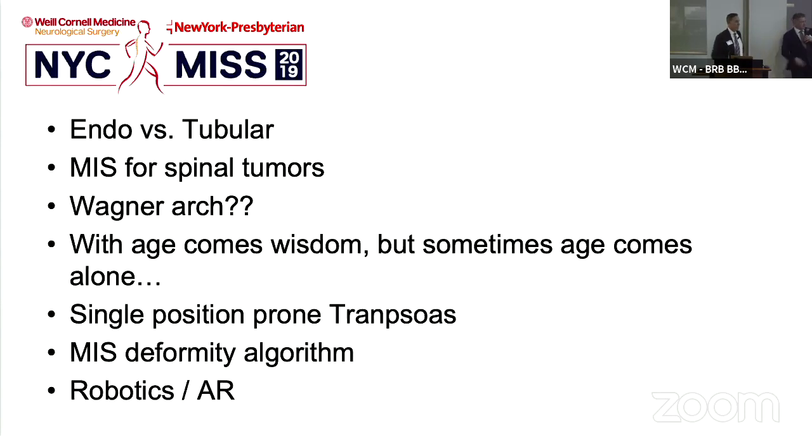Yeah. But let me ask you that question now. When navigation was introduced, the data show that there's a real reason why navigation is helpful, because it improves accuracy, right? What's really the advantage of augmented reality for pedicle screws? Is there anything other than, is it like endoscopy versus tubular? Is this another way of doing a microdiscectomy? Another inflammatory comment, or is there a real advantage? Or is the advantage down the road at some point?